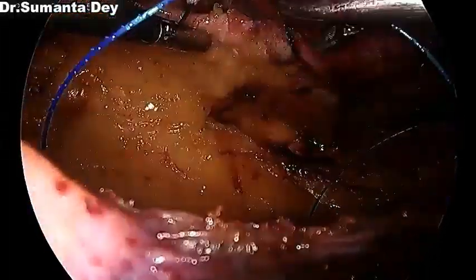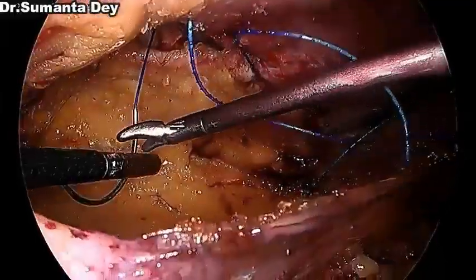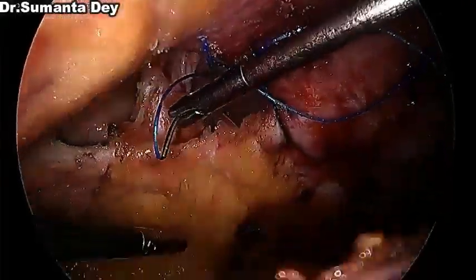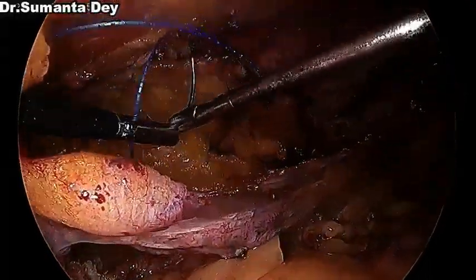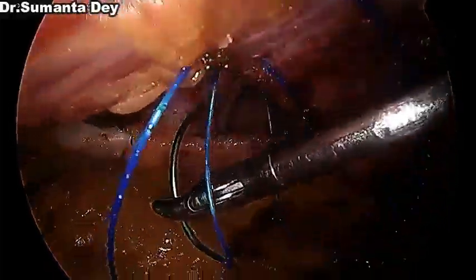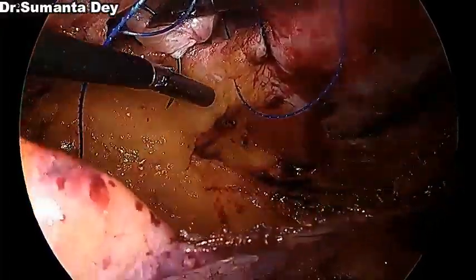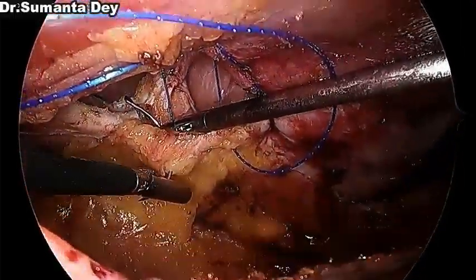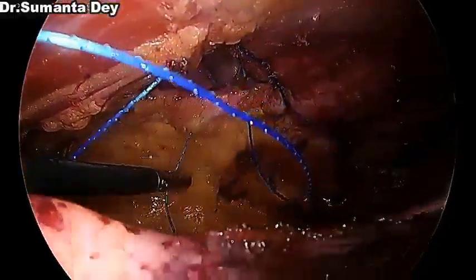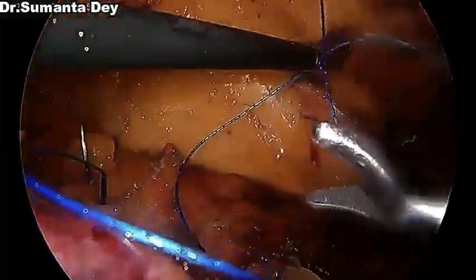While closing the defect, I am taking one or two bites of the hernial sac, so that I can obliterate the potential dead space of seroma formation. So chances of seroma formation will be less if you close the hernial defect along with the hernial sac. Closure of the hernial defect is an essential part of any hernia repair, I mean ventral incisional hernia. That will prevent, number one, seroma formation. Number two, there will be less chance of mesh migration and pseudo hernia formation or other complications following hernia repair. And defect closure is always recommended.